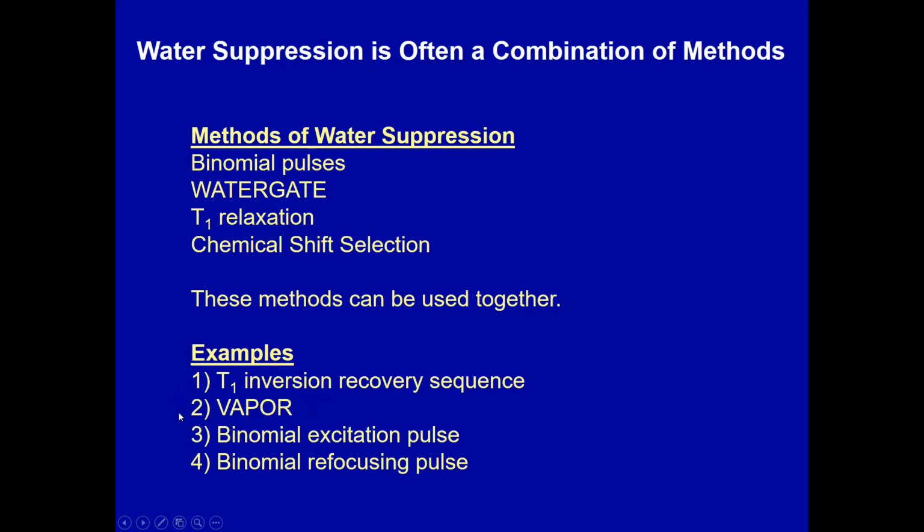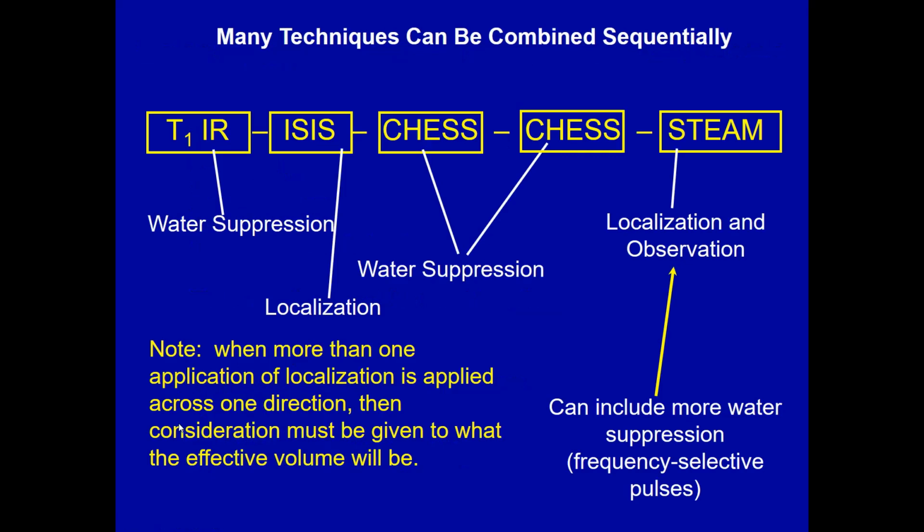So what happens when we're developing pulse sequences, we just test to see what we think will work. We'll develop a STEAM sequence, and we know that STEAM by itself is not going to suppress water.